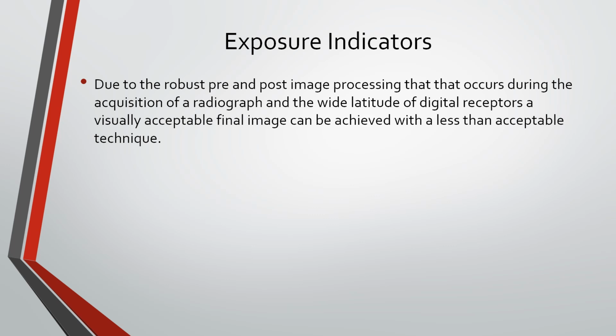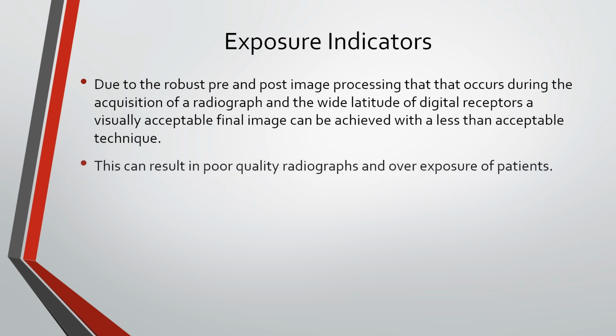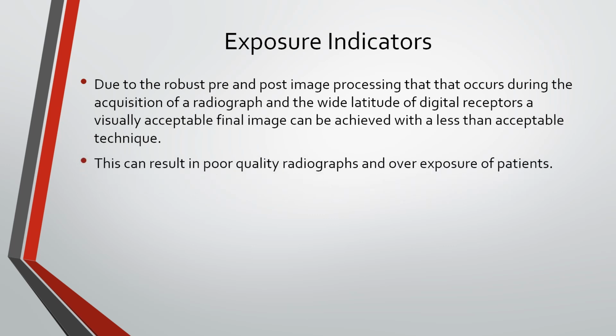Us as quality radiographers, that's our goal. Our goal is to use quality techniques. This can result in poor quality radiographs and overexposure of the patients. Okay, so overexposing a patient is not being a quality radiographer.